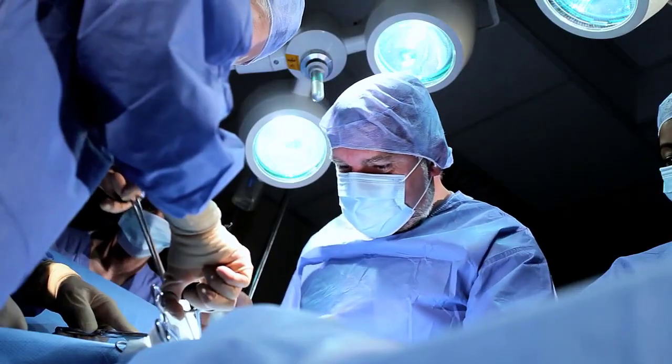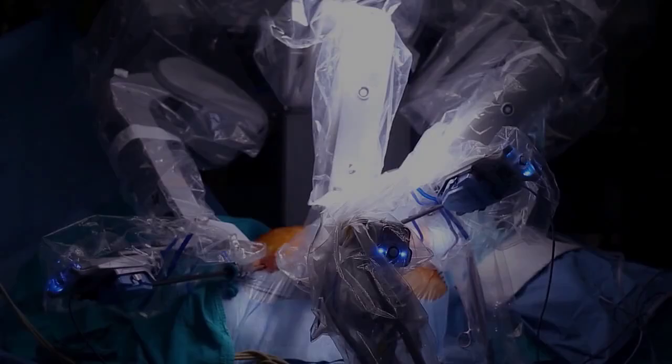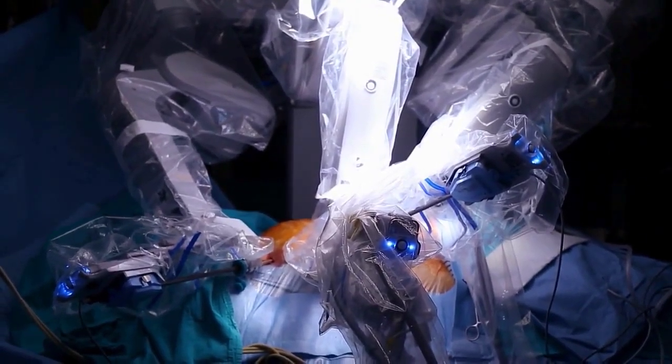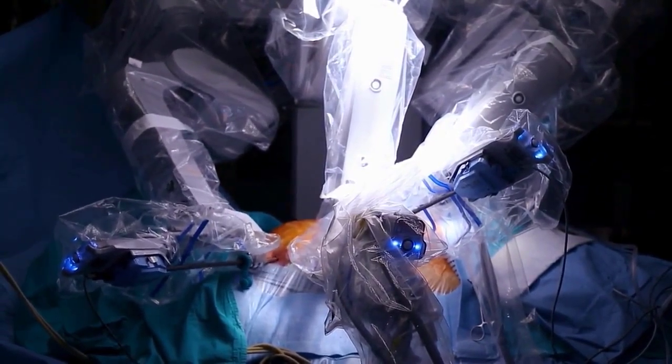Almost half the patients with cancer are treated surgically, and today more and more we perform minimally invasive surgery rather than open surgery. One of the disadvantages, especially in robotic surgery, is the lack of the sense of touch.